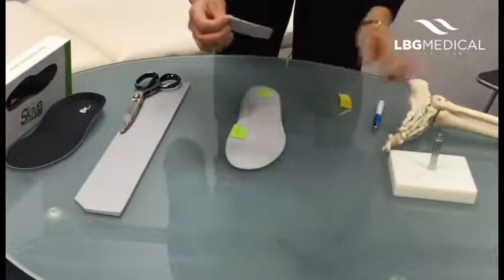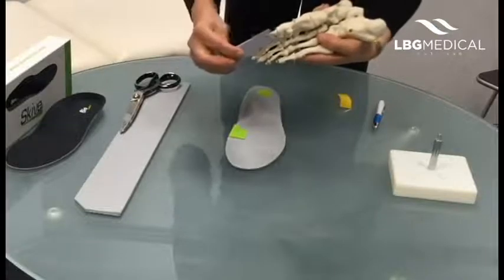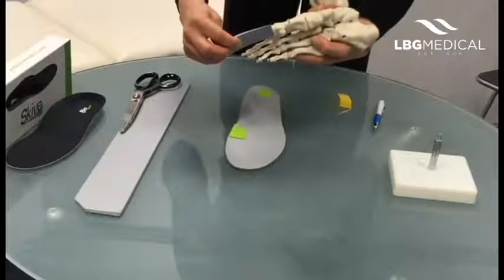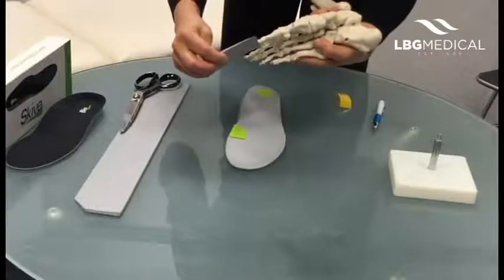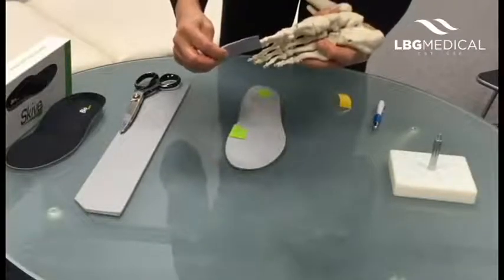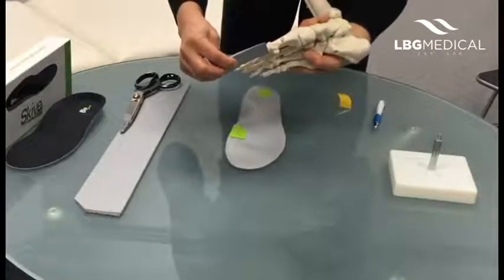The other thing you need to bear in mind — I'll show you on the foot model here — is that the posting needs to come far enough down so that you're dorsiflexing the first metatarsophalangeal joint. If you come too far back you'll be putting too much pressure and dorsiflexing the wrong joint, so it has to come right back to the first MPJ.